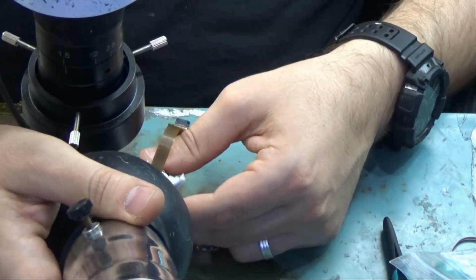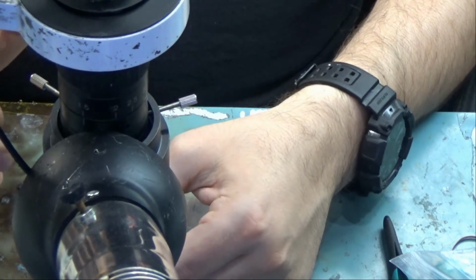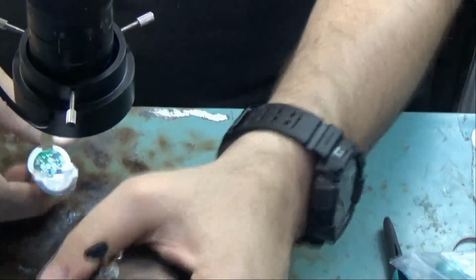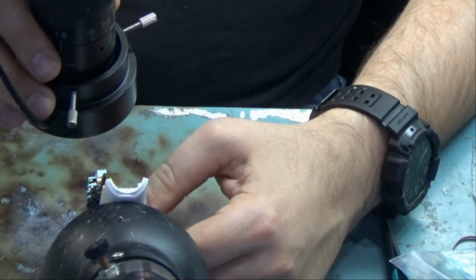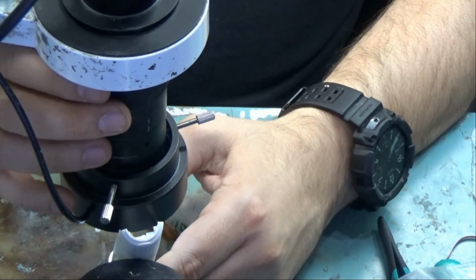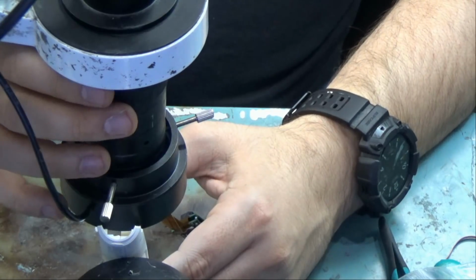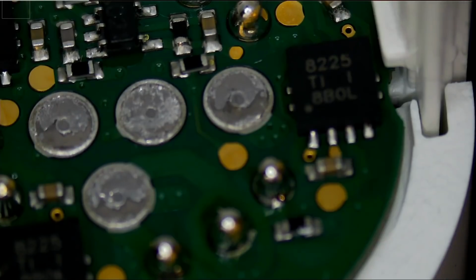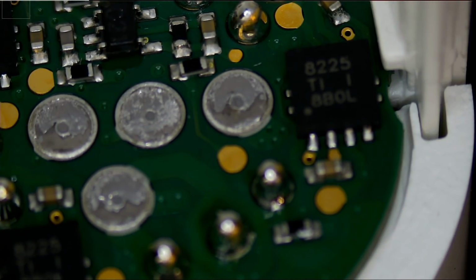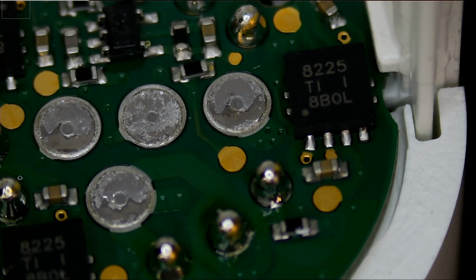I'm gonna use the fume extractor to hold that tool, and the microscope... okay, let's see, and right there. All right, so let me show you what I'm looking at. I have the tool tilted at about 45 degrees, so it's not vertical, it's tilted. And as you can see, we have 4 pads that are supposed to have 4 pins on them. We do have the pins, and the pins are gold plated.